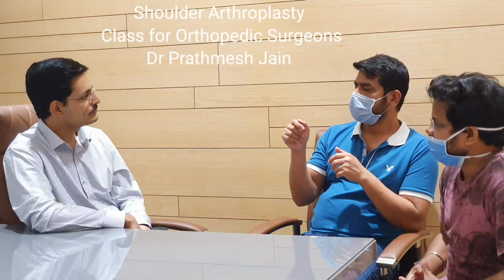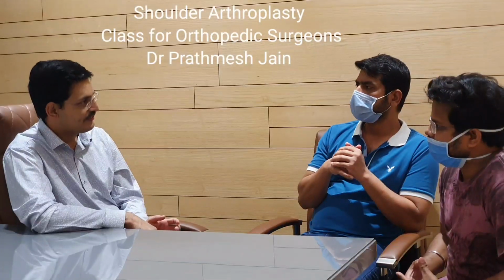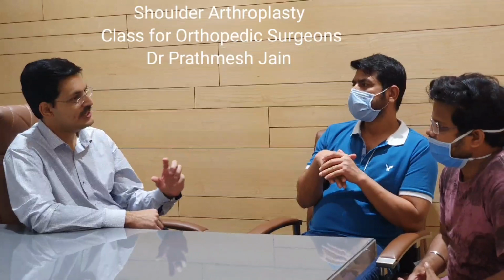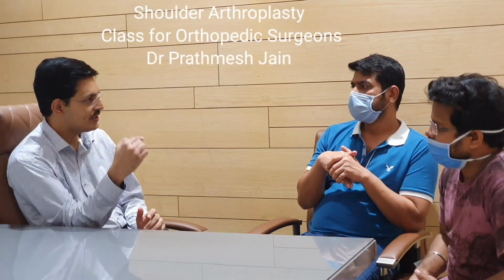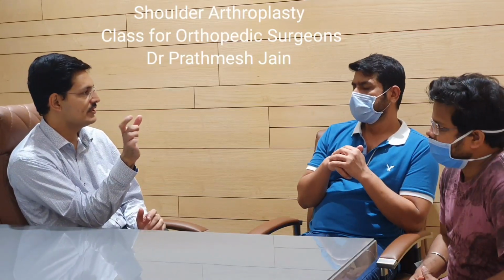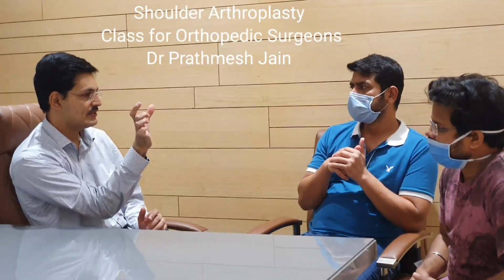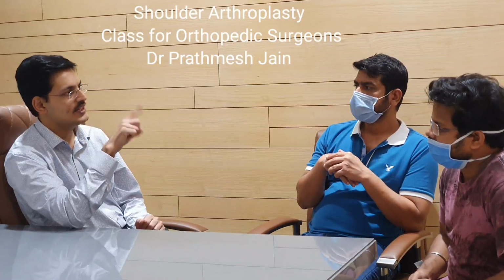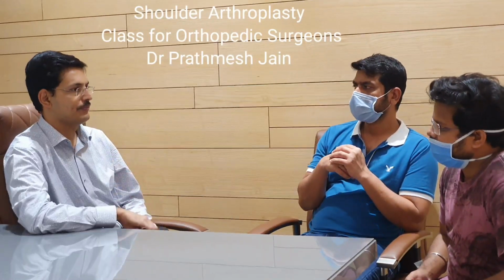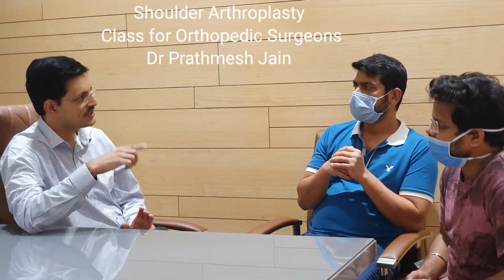What is the angle that is used nowadays? 135. 135 is used nowadays. Earlier it was a flatter design, so it was 155. It had more vertical offset and less horizontal offset. Nowadays it is vertical and horizontal both. So with the older design, the chances of notching were more. With the newer design, the chances of notching have reduced.